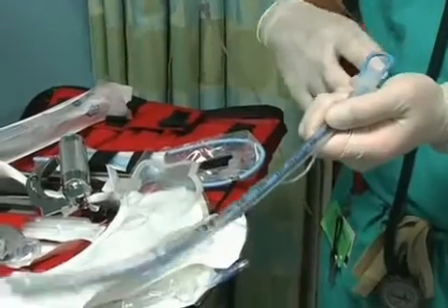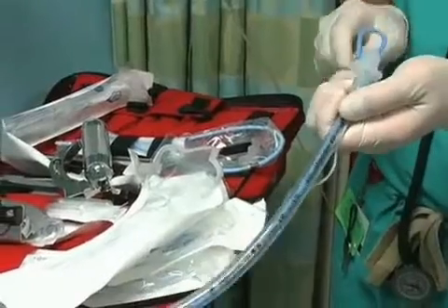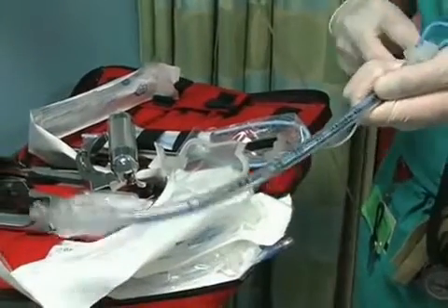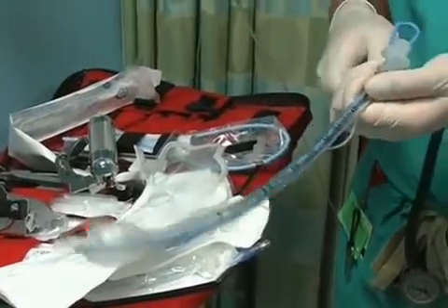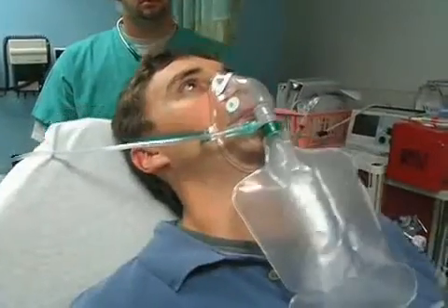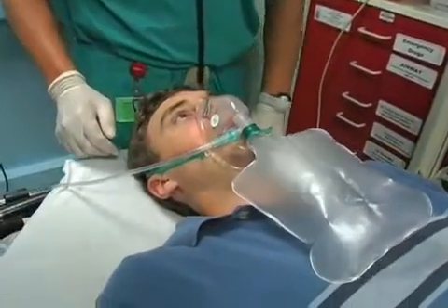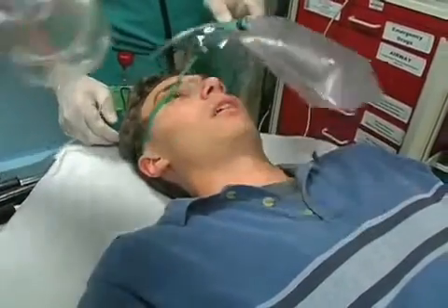Here we see preparation of the equipment while the patient is being pre-oxygenated. In real time, the pre-oxygenation begins approximately 5 minutes prior to the actual intubation. In anticipation of drug administration, the patient's head is lowered and preparation is made for bag valve mask ventilation.